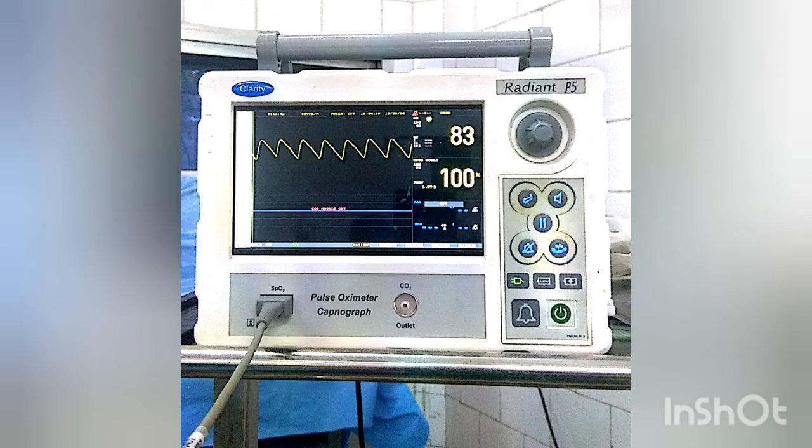Last but not the least, there are now different kinds of pulse oximeter available in the market: a fingertip pulse oximeter, or the one which is attached to a multi-para monitor, and some special types of oximeters like co-oximeters, which can differentiate between normal and abnormal hemoglobin.